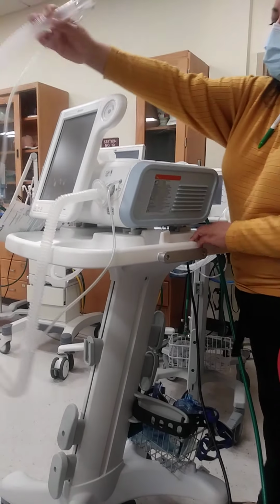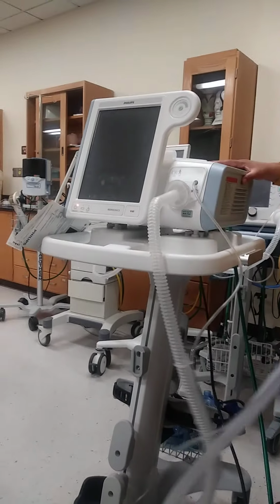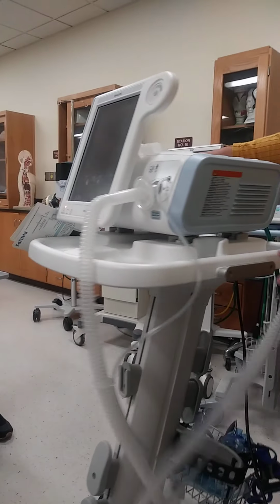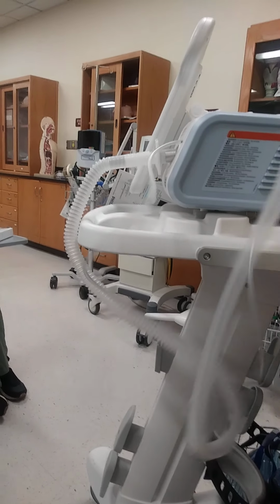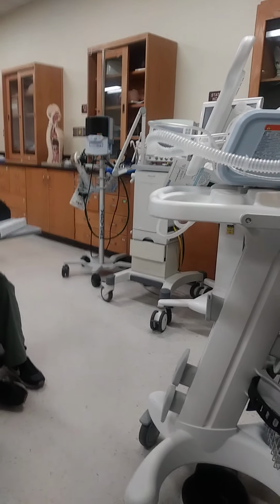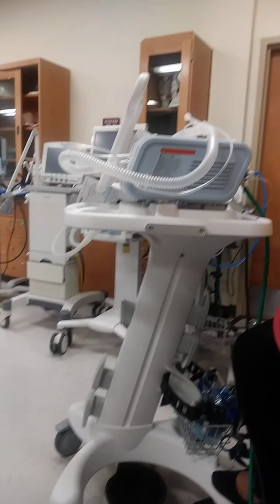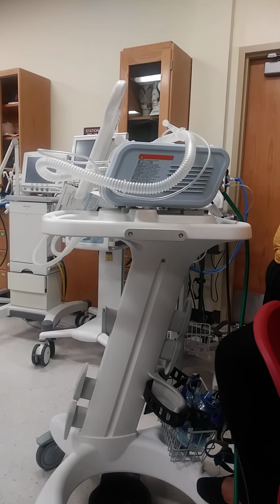Which is nice. All right, so oxygen connection to the wall, plug in, okay? Here's my tubing. All right. Okay, so what types of patients do you guys think I'm going to put on BiPAP? Drug overdose, right? What was it? Drug overdose. So that's actually, let me tell you the contraindications, okay?